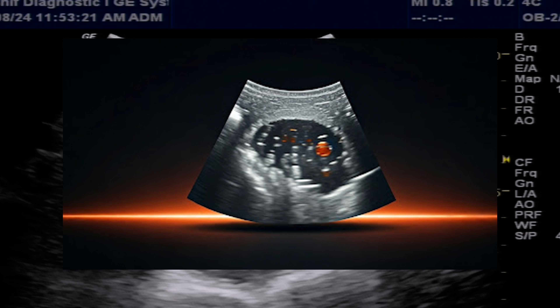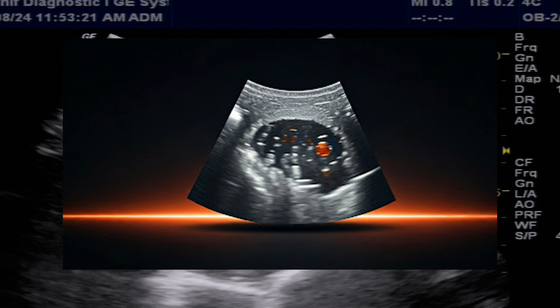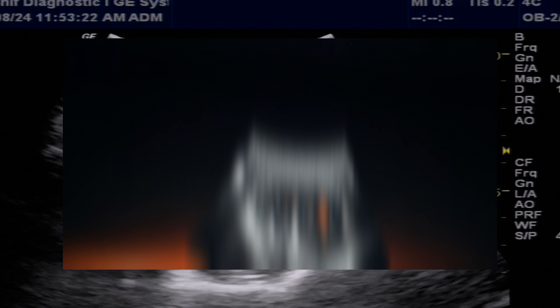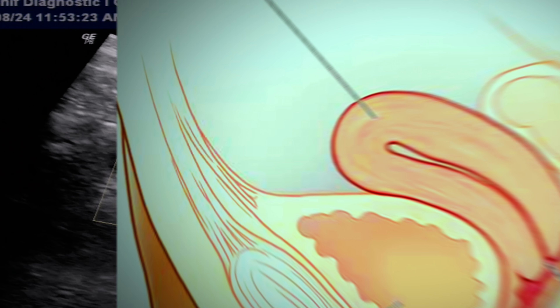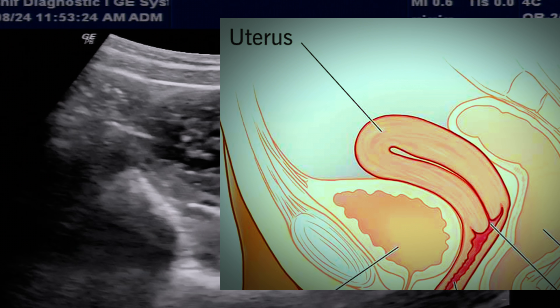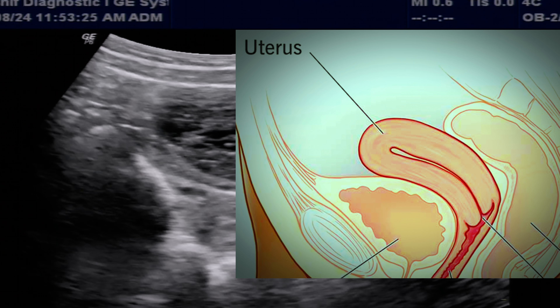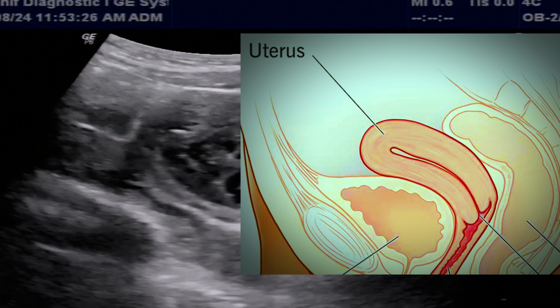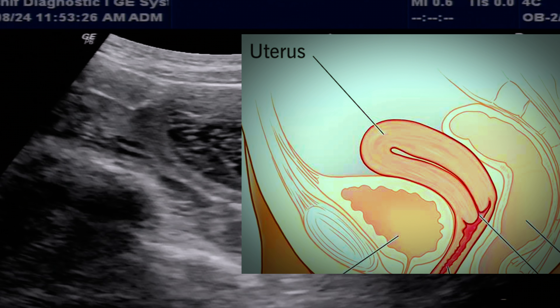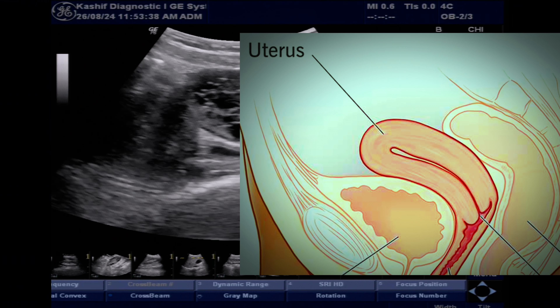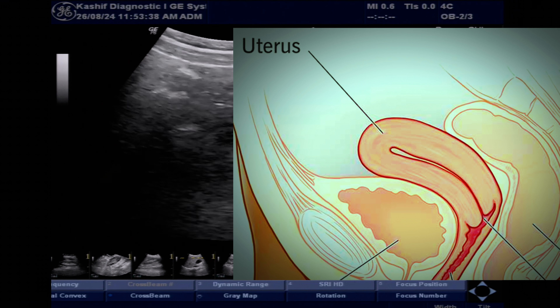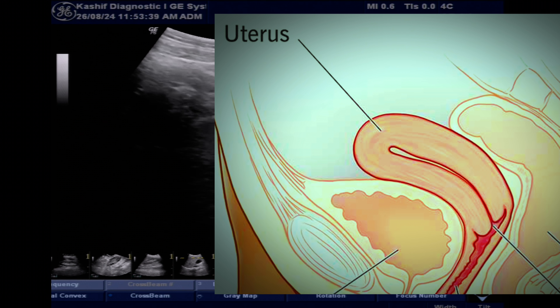Ultrasound plays a crucial role in diagnosing fertility issues in women. Abdominal ultrasound or transvaginal ultrasound can visualize the female organs, including the ovaries, uterus, and adnexa.